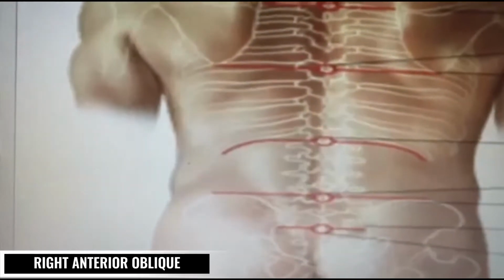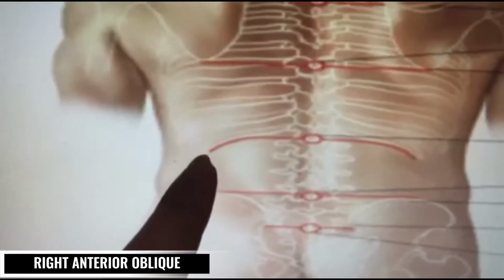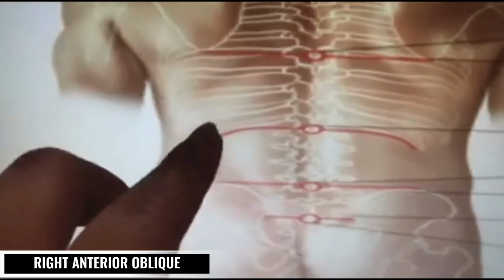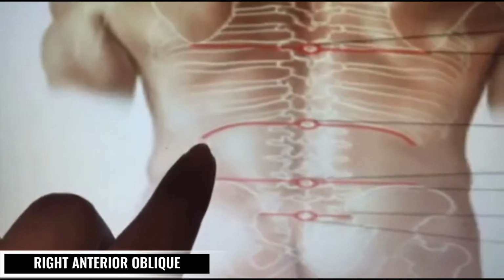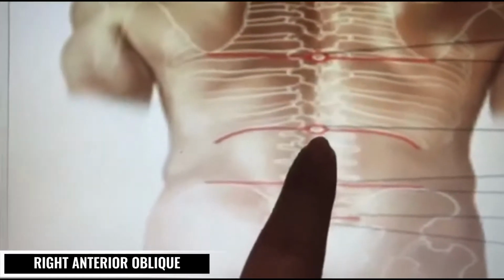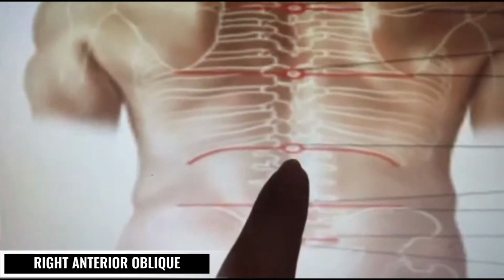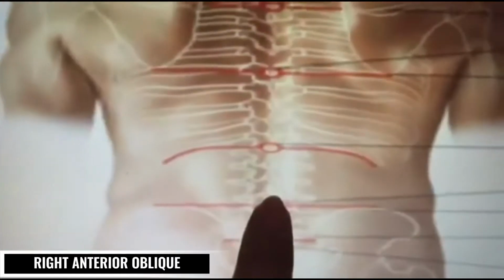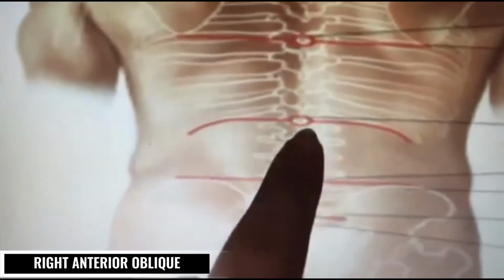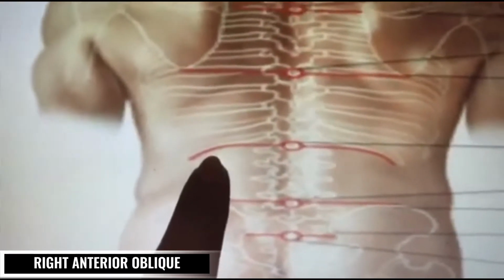We can determine L1 by palpating the lower border of the rib, 1 to 2 inches above. This is the L1. So we put the central ray at the midline between the spine and the lateral abdominal border, here.